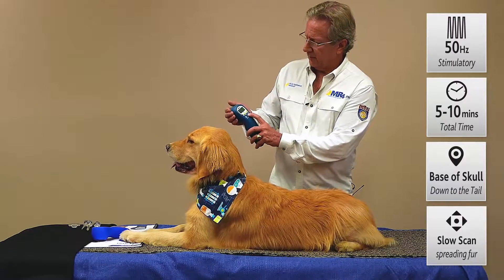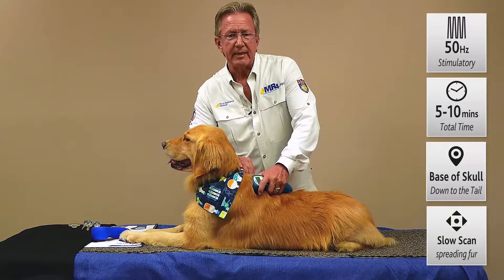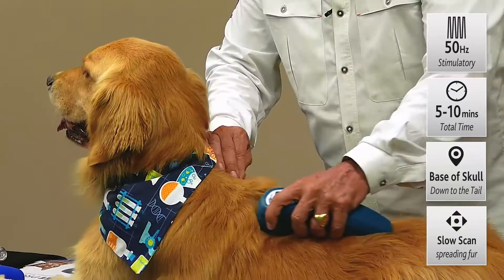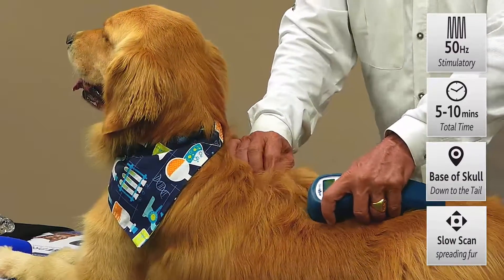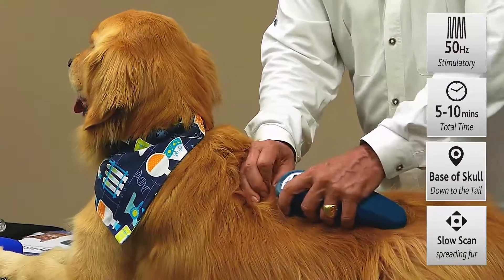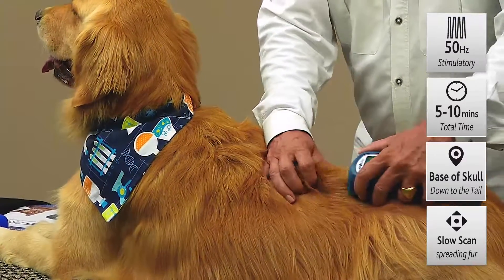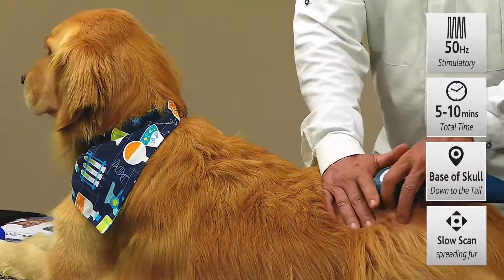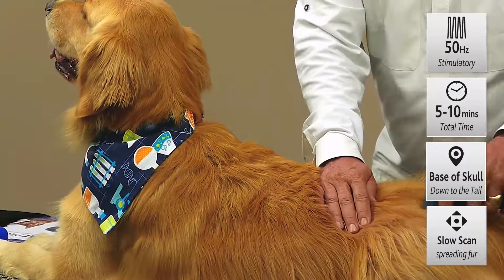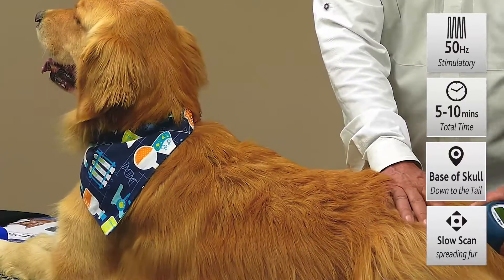We're on the 10-minute timer which is perfect. Just push the start button — that's when we want to increase metabolism in these tissues to improve blood flow. We're not looking for pain relief now with an inhibitory frequency of 1000 Hertz; we're looking to stimulate with a frequency of 50 Hertz. What that's doing is photodissociating nitric oxide into the blood — a natural vasodilator — which is going to improve circulation on those micro capillaries and improve metabolism by bringing nutrients in and getting waste products out.